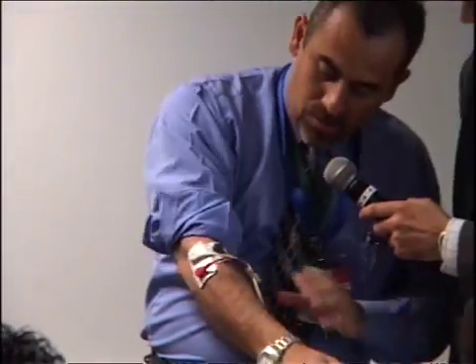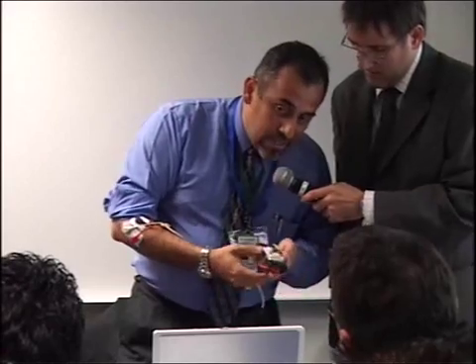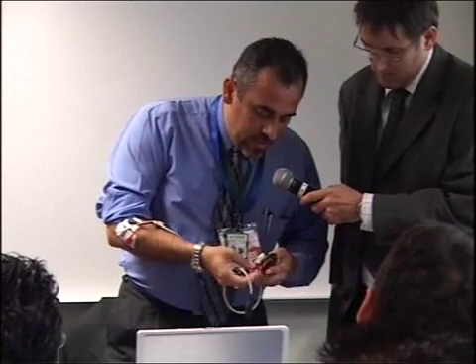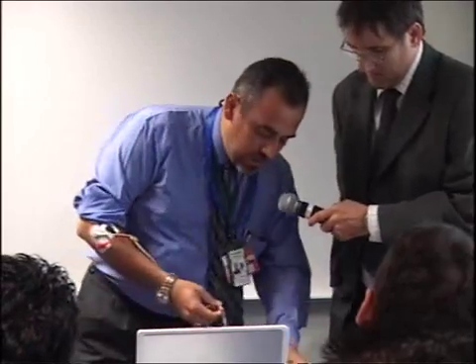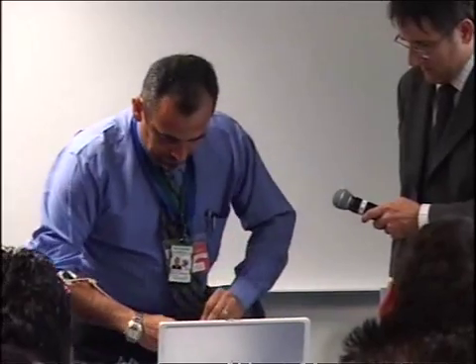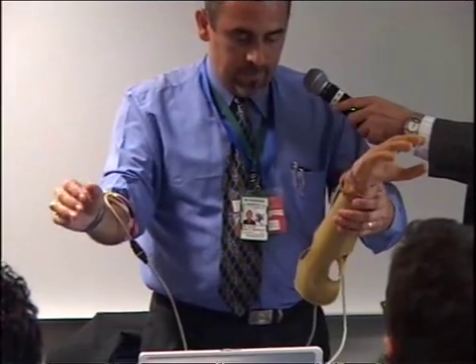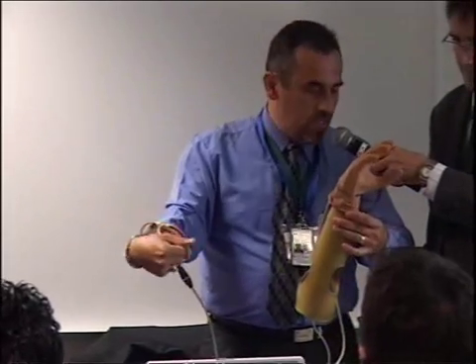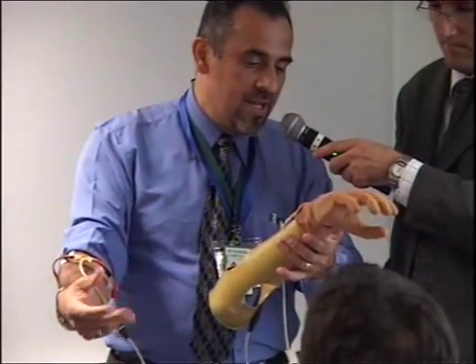Six connectors. Six leads, an electrode pack. This is the battery, the rechargeable battery. I need some voltage for the electronics and for the servo motor. I now connect the battery. I am extending my fingers now. I open the hand, and if I do a flexion movement of the fingers, now it's beginning to respond.